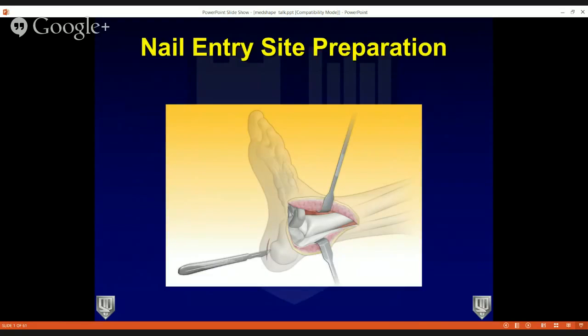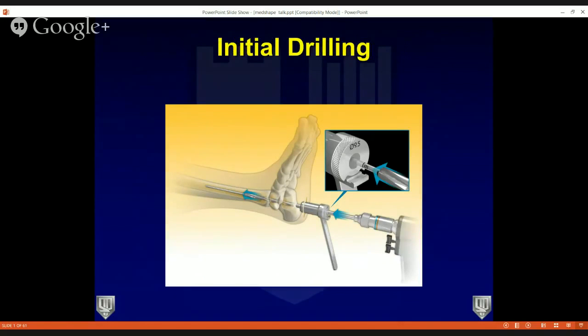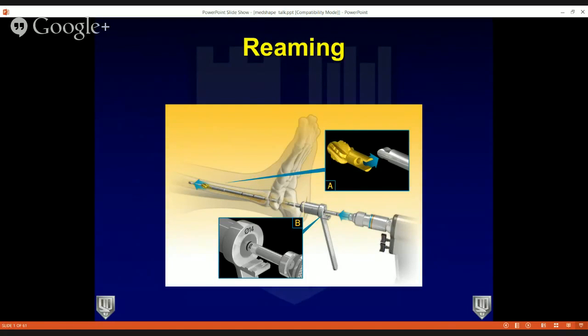The insertion technique is a little different from what you'd normally see with TTC nails. You can prepare the joint like you normally would. Plantarward, make an incision — I typically make it longitudinally, almost at the midpoint between the medial and lateral aspects of the foot, just where the plantar heel pad goes into the arch. Spread down with a mosquito right to the bone. Under C-arm, check the guide wire placement on both AP and lateral. Once you like the guide wire placement, put the soft tissue protector in, and do your initial drilling through the calcaneus, talus, and into the tibia, then begin reaming until you get chatter through the isthmus.